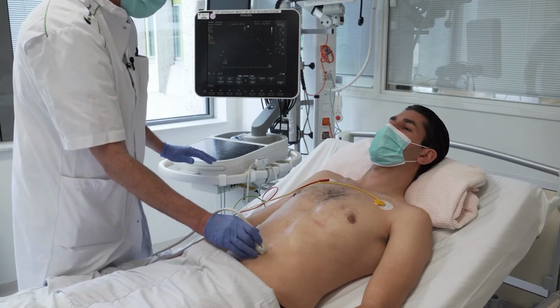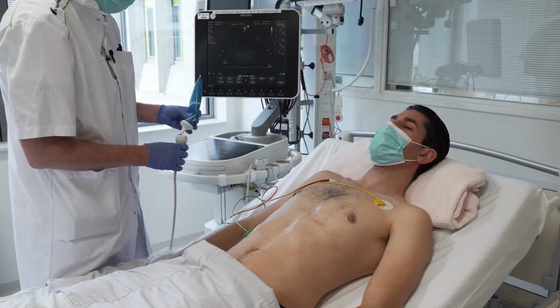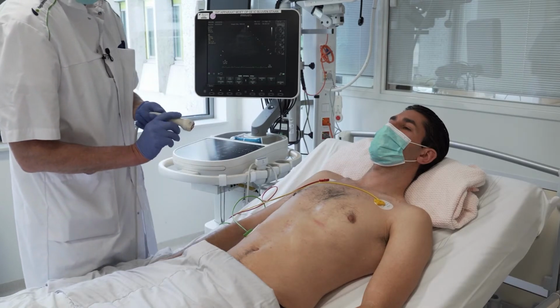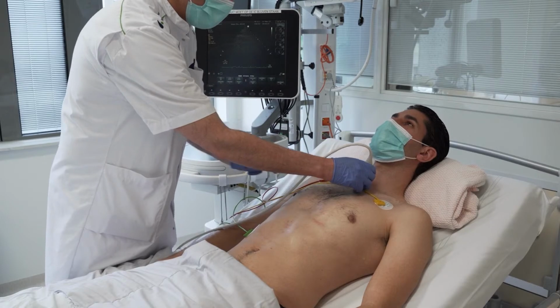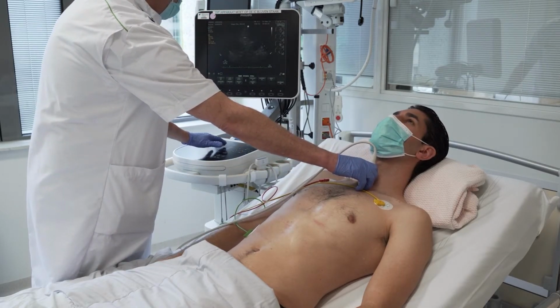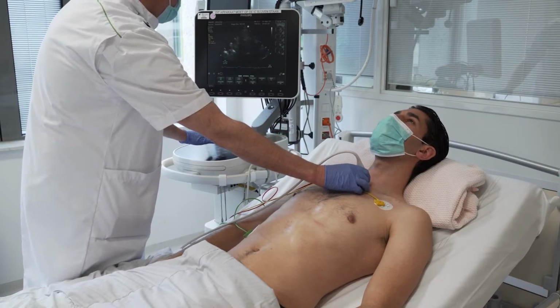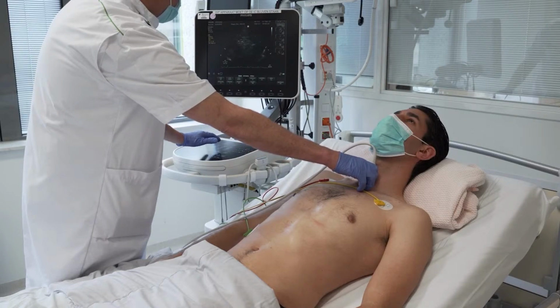To conclude, we would like to show you the suprasternal view, which can help you in diagnosing a type A dissection. This is less known actually. You really have to zoom in, and you have to be a little bit lucky to see the aortic arch.